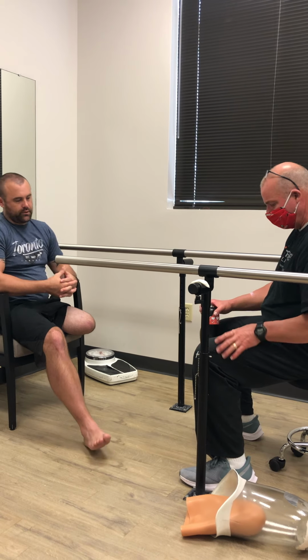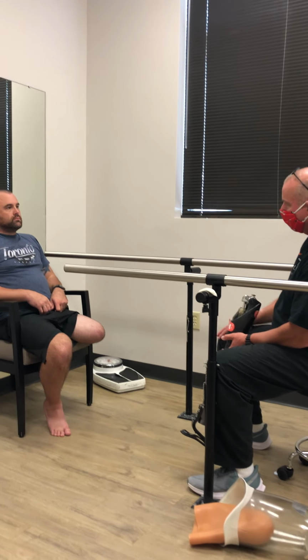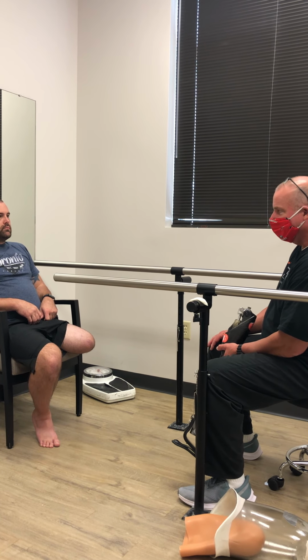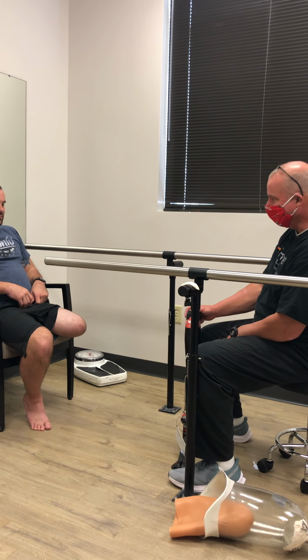Cool. So that's easy enough, but that's part of what I was telling you earlier: if you don't keep in contact with me, I can't help. Yeah. And you look at some of these amputees that will come back in 5 years and go, man, this thing hasn't been working right. And I'm like, yeah, really? It's like not changing your oil.